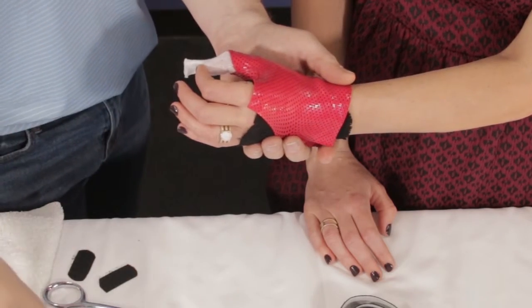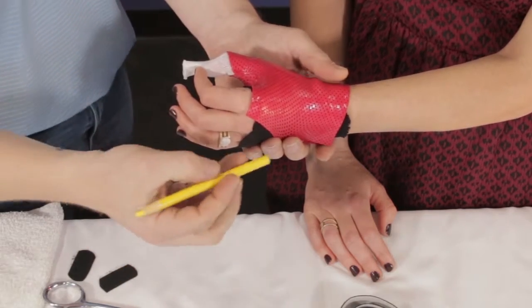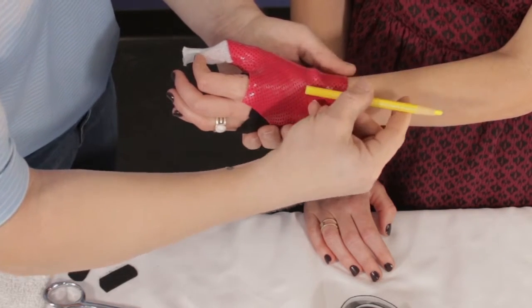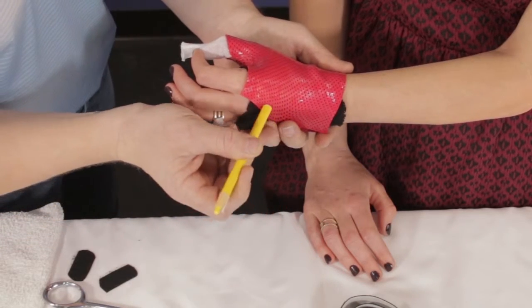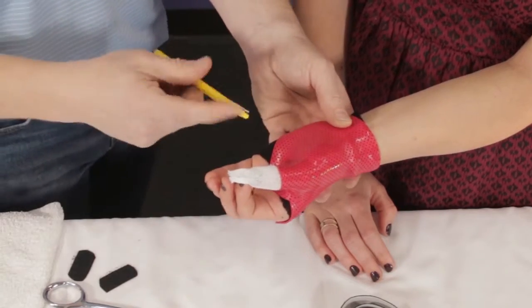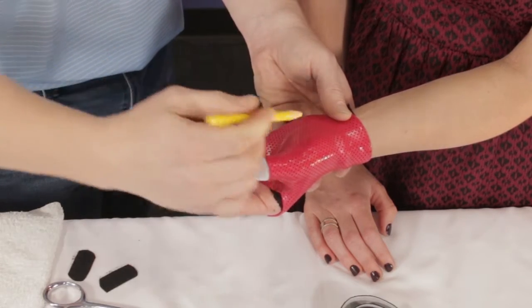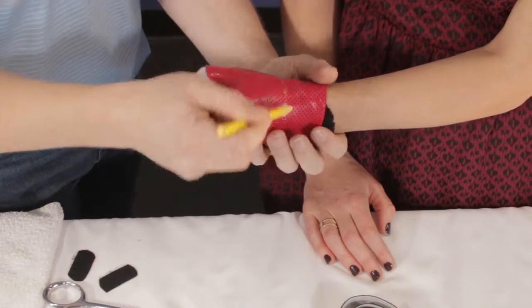If you wait another 30 or 40 seconds, you can use a yellow pencil — or your fingernails if you have them. I'm going to make my line, coming really far around the backside and avoiding that snuff box, coming this direction around here. I like having lots of coverage on the dorsum of the hand. On the palm side, I'm going to come right through that thenar crease up to that web space, then come around and finish all the way onto the back of the hand.